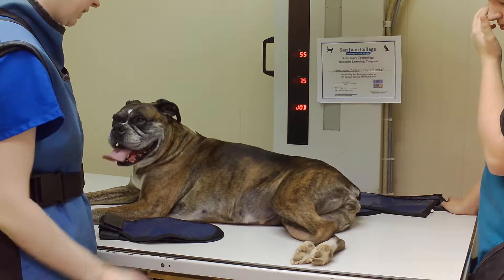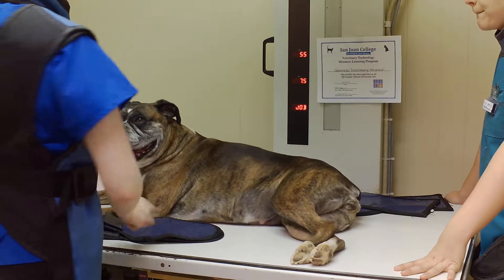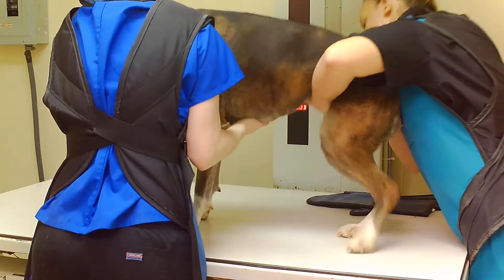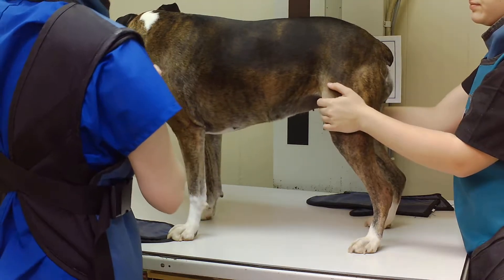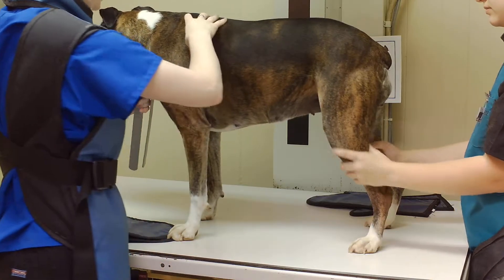Once we get ready to go, we're going to flip her over to the other side. I'm going to get her in standing position to measure her. We're going to measure where her scapula is.